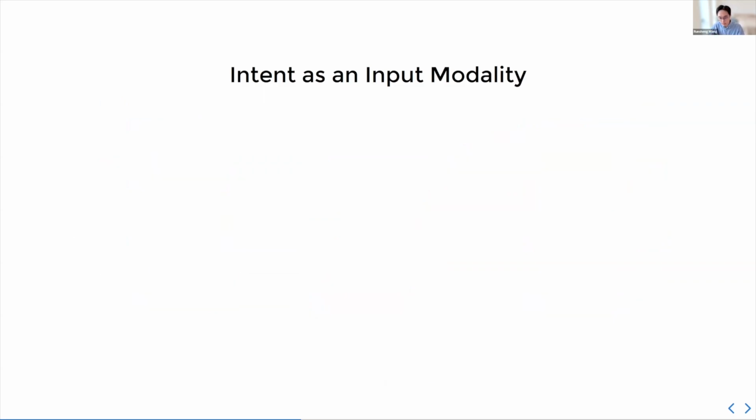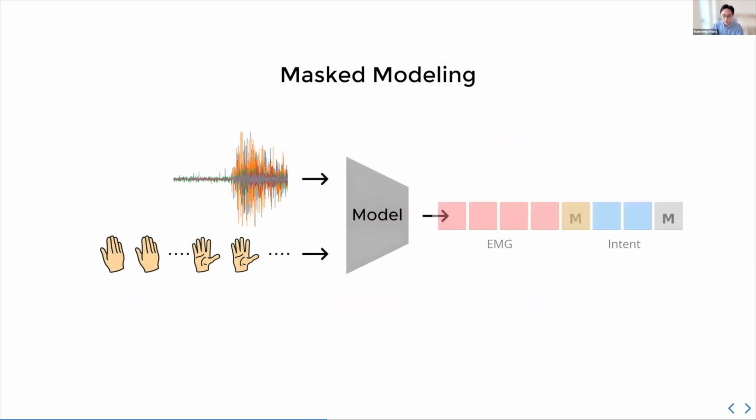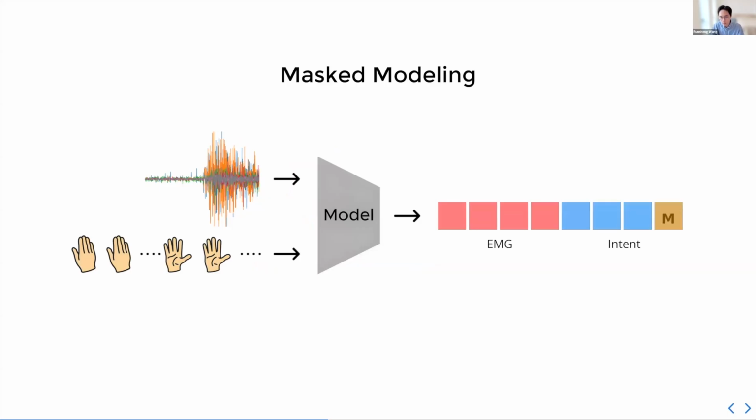So we're asking, can we do the same thing here? Can we put EMG and gesture both as input and get some output, right? So what is the output? In this case, we're formulating this as a BERT-style mask modeling problem, where we mask different parts of the input and ask the model to reconstruct the masked portions. So this turns the supervised problem into a denoising problem, almost.